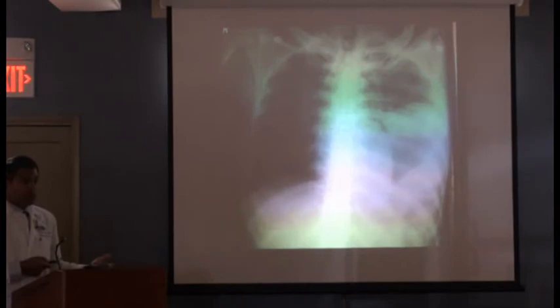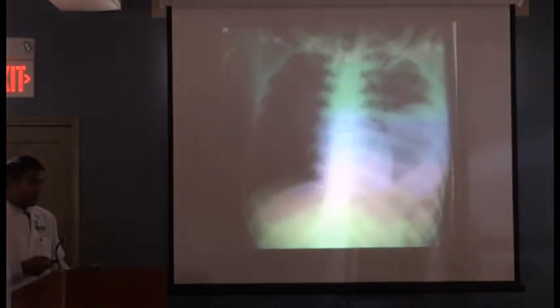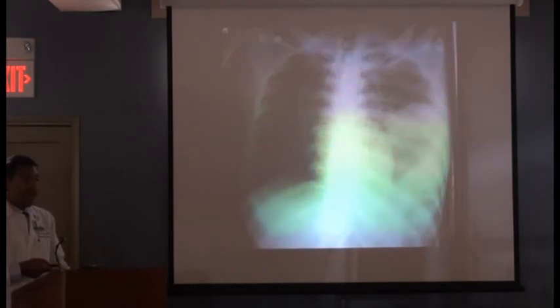Good. So one is possibly an abdominal wall hernia or a diaphragmatic hernia. That's a possibility. How would we diagnose that? Good. Absolutely right. Put an NG tube down, and then you might be able to see it in the left chest. That's one possibility. What else could be going on here?